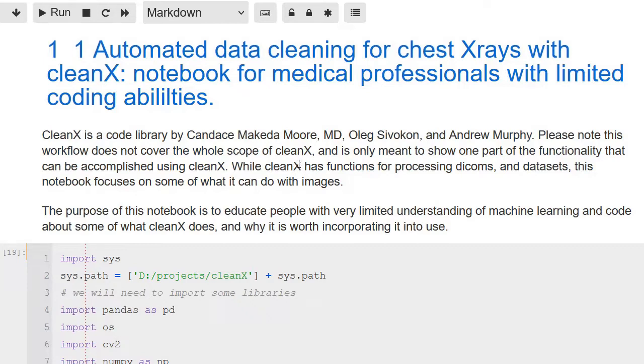If our hardworking radiology professionals already don't have time to read all the existing x-rays, how will they have time to read more to create an algorithm? It's almost like in chemistry, when if you could get past a certain energy of activation, you could change the whole system, but the system doesn't necessarily push it that way. cleanX can help.